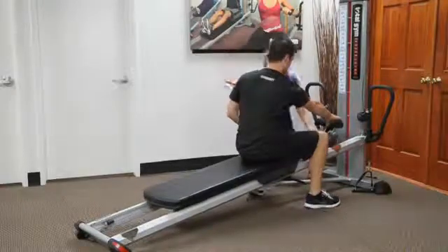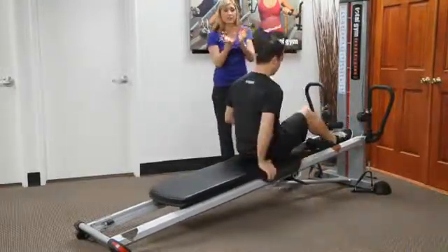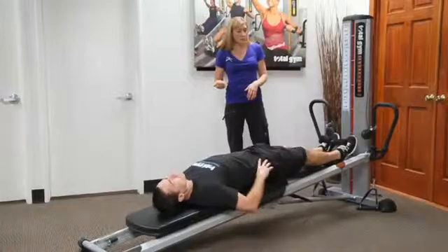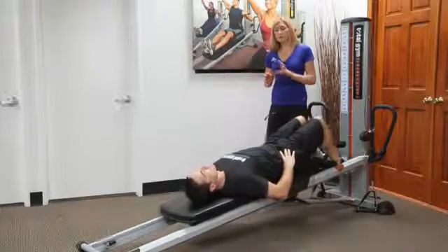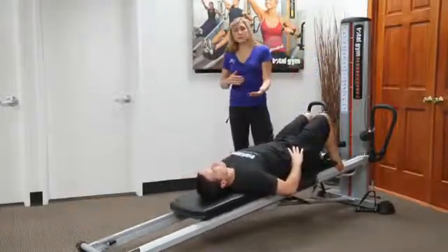The other way is they pull themselves up, they turn their foot out, always lead with the heel to get in and out of the foot holder, and then they can lie onto their back. So we're gonna do a hamstring curl, and basically he's gonna bend his knees and come up and come back down. And there's a challenge here because there's a point where you might wanna increase the resistance.